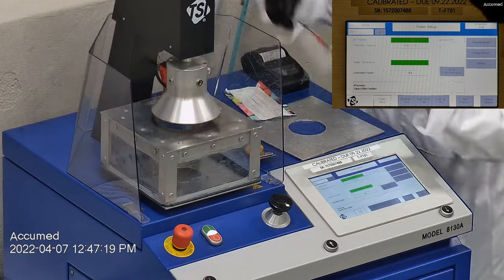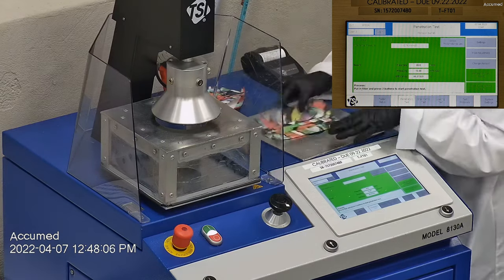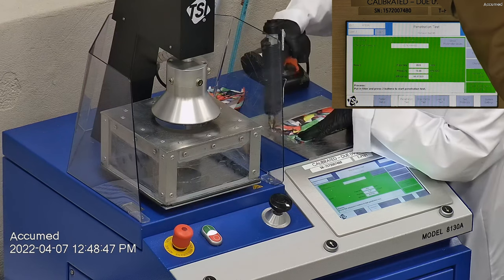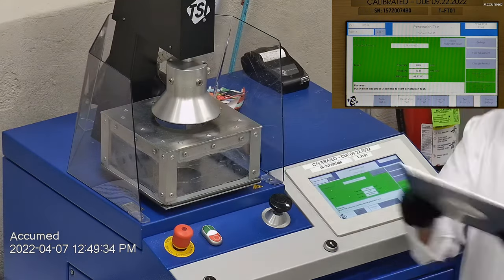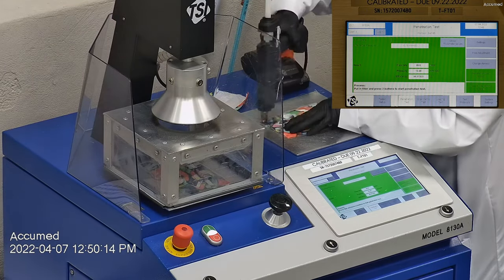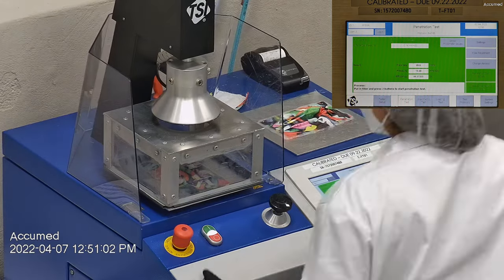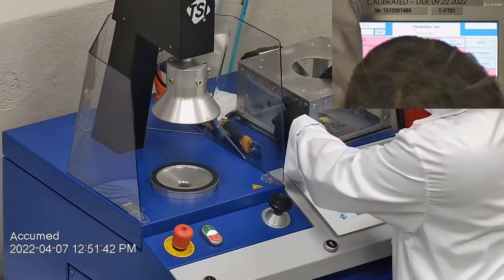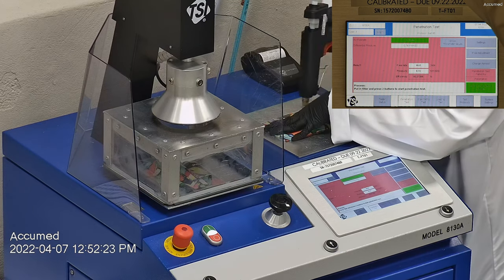This is our TSI machine model 8130A, which is the same filtration testing machine that NIOSH uses to approve N95 respirators. Our procedure is also inspired by NIOSH. We first run the tester setup and start removing the headband from the respirator or mask before placing it onto the testing plate to ensure a proper seal. We make sure the mask is completely sealed with hot glue, with no holes or leakage around the seal to ensure accurate results. The testing plate is then attached to the frame and placed under the TSI filter holder for testing, which tests for both particle filtration efficiency and pressure drop.